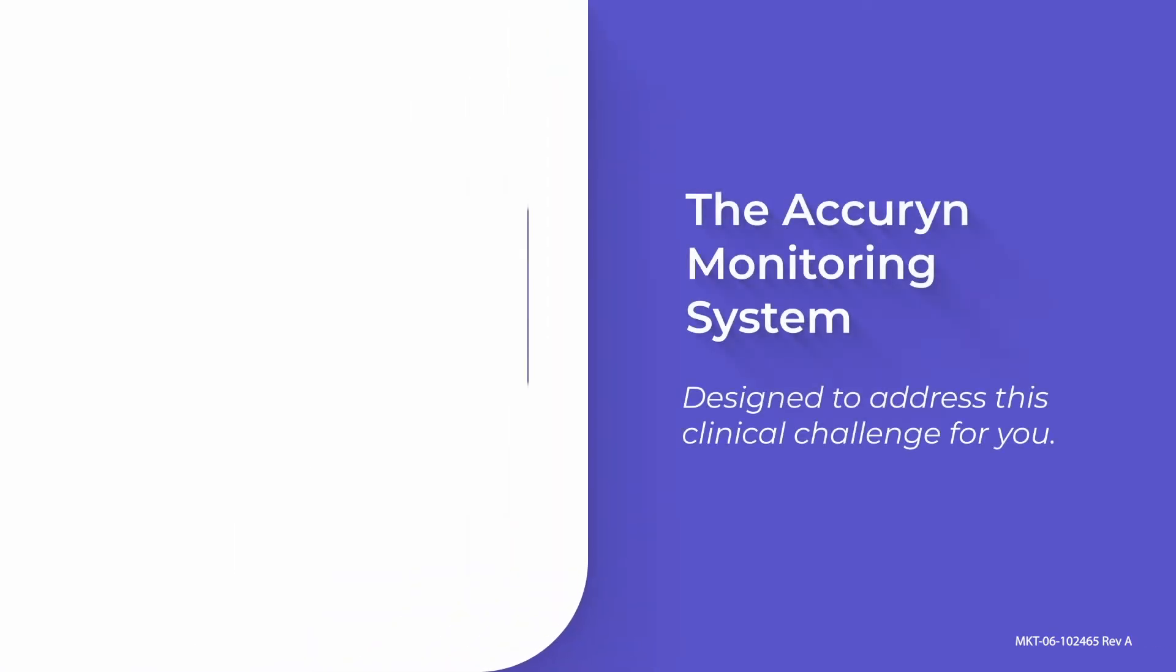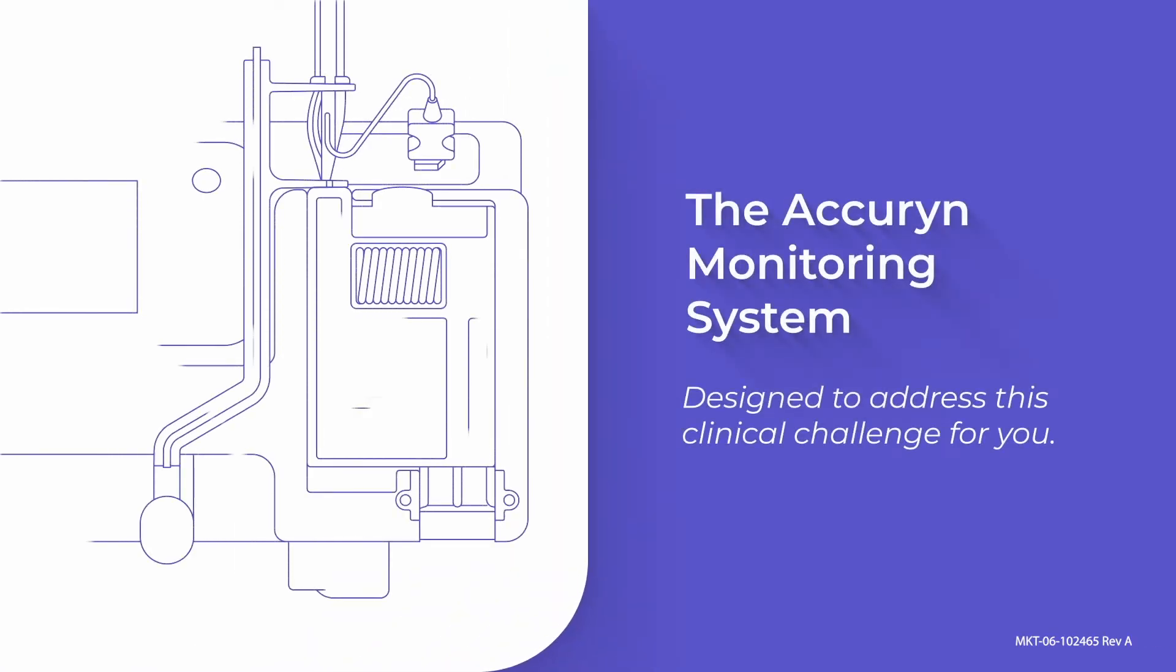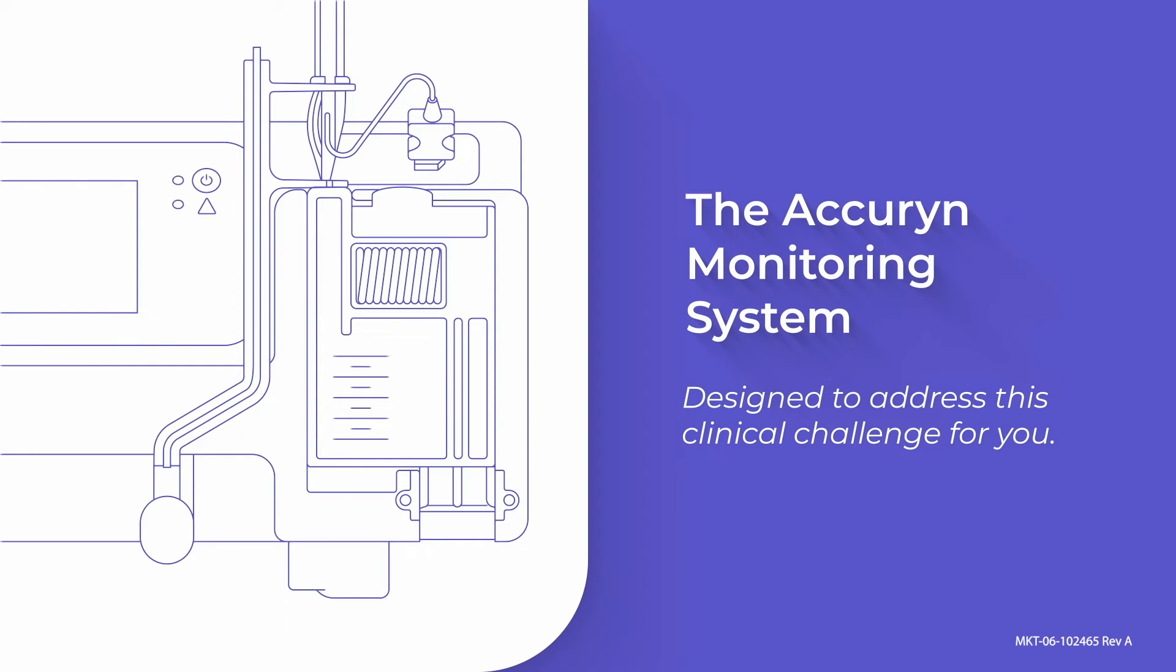The Accurin Monitoring System, with its proprietary active drain line clearance, was designed to eliminate this need to milk the Foley, so that every milliliter of urine can be accounted for as it is being produced.